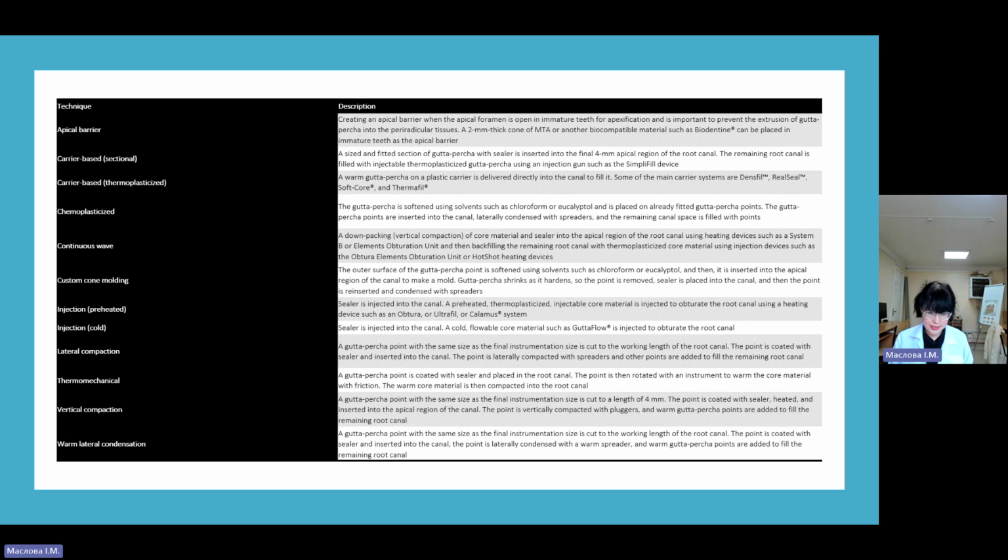There are other types of sealers. Use of chloroform-based sealers such as rosin chloroform, chloropercha has declined due to concern about their toxicity. Formaldehyde-containing sealers are no longer recommended because they contain substantial amounts of paraformaldehyde and are considered unsafe.